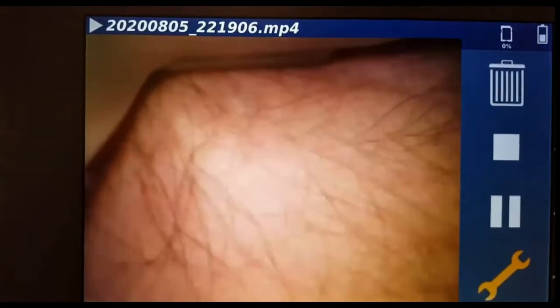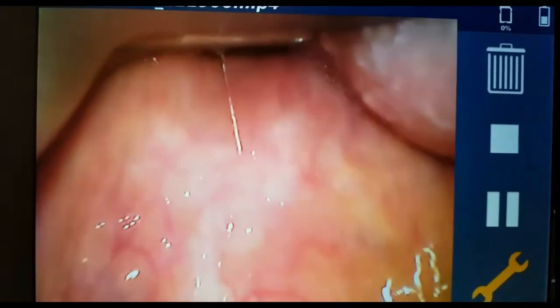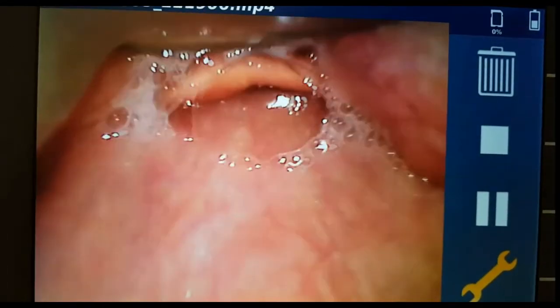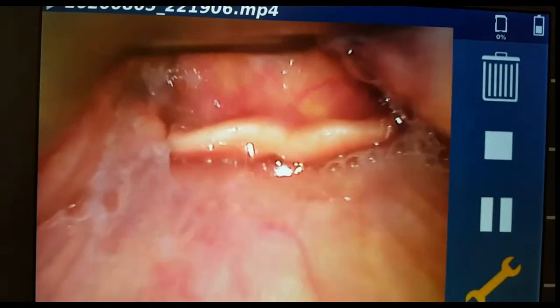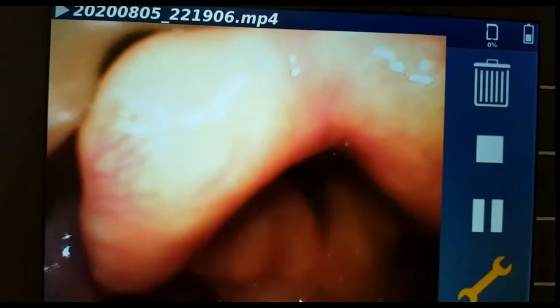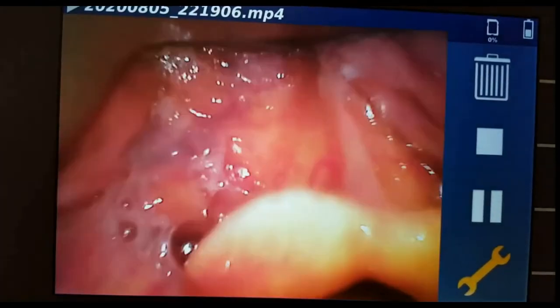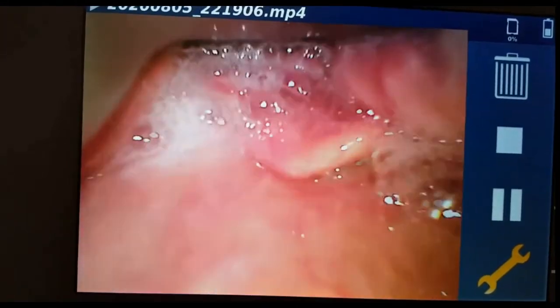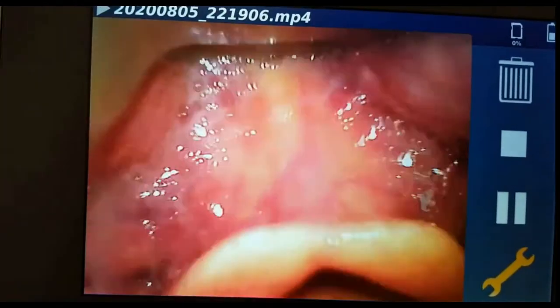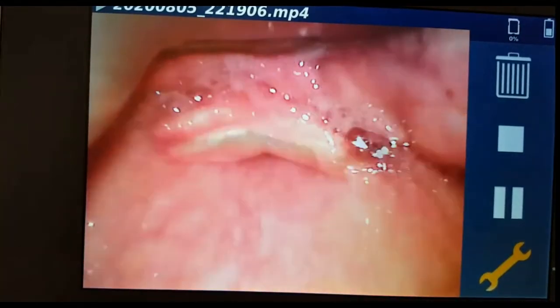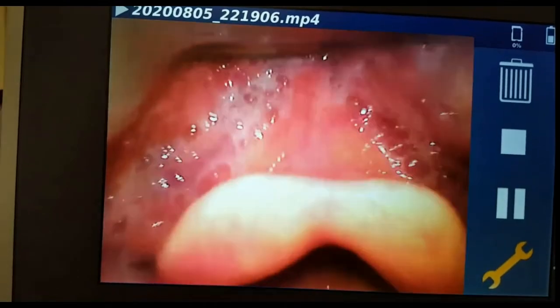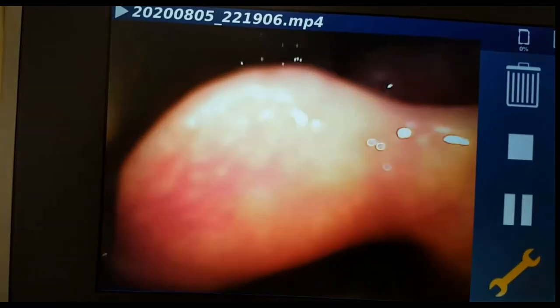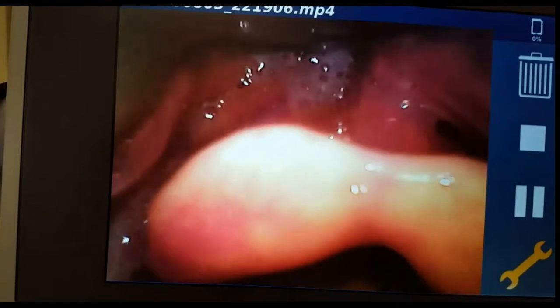First, we put the video laryngoscope into the mouth. We can see the tongue, and that is the epiglottis. The tip of the video laryngoscope is in the vallecula. There is quite a bit of secretion, and because of the large tongue it was a bit difficult to position the video laryngoscope.